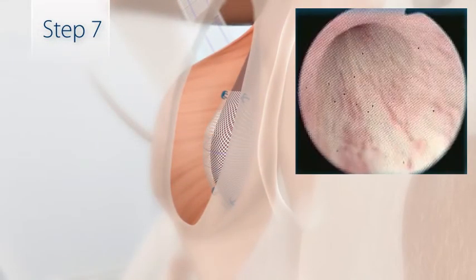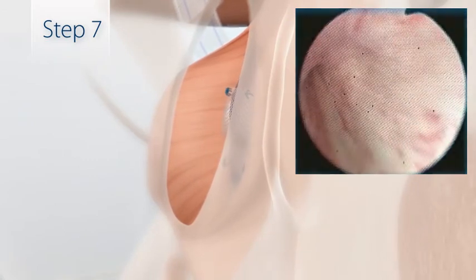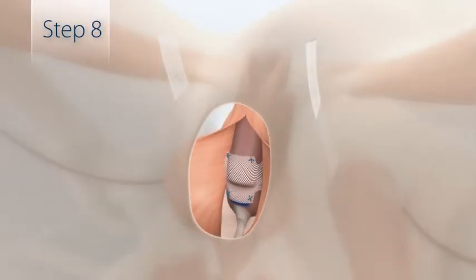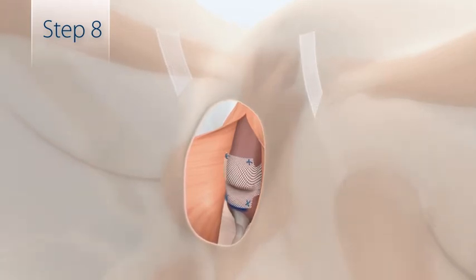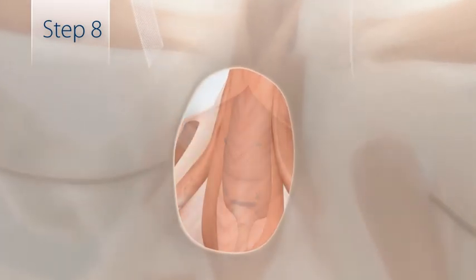Flexible cystoscopy is recommended at this time to confirm proper sling positioning, as shown here. Once correct positioning is achieved, remove the plastic sheaths from the sling and confirm sling tension. The procedure is completed by closing the bulbospongiosus muscle, the rest of the perineal incision, and the stab incisions.